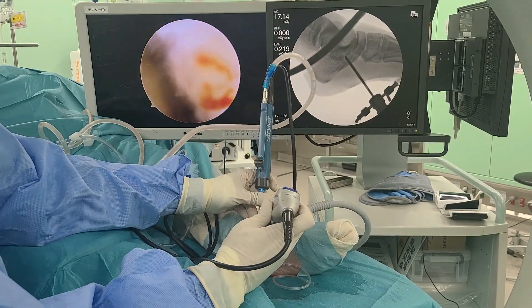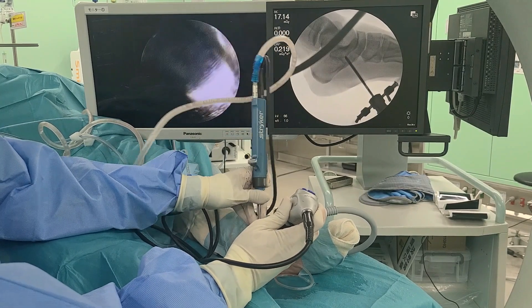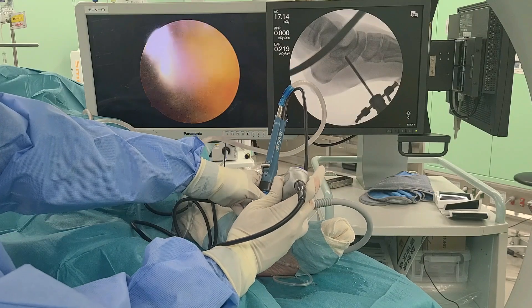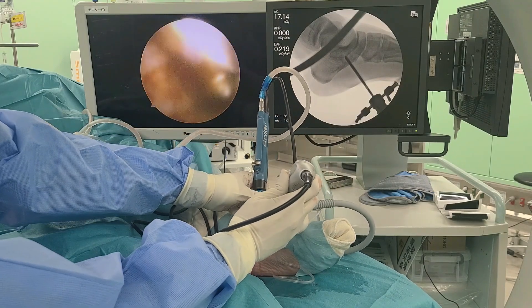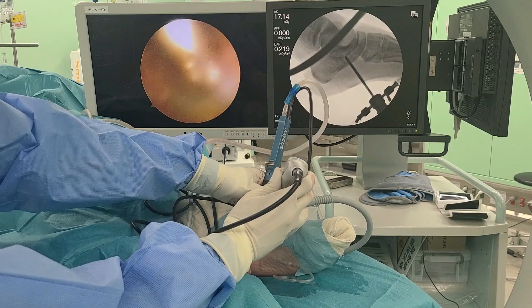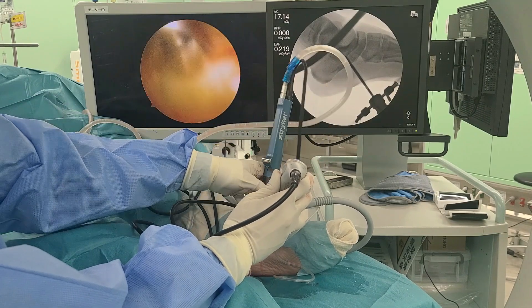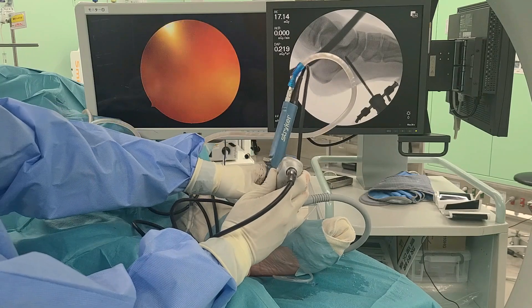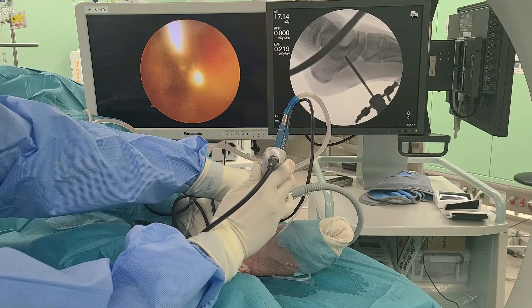Heat necrosis is a complication that requires careful attention. It is challenging to resect the portion of the accessory navicular near the skin, since the medial foot makes it difficult to navigate the abrasion burr, which gradually heats up over time. Thus, while resecting the portion of the accessory navicular near the skin, the burr should be cooled down with endoscopic saline.